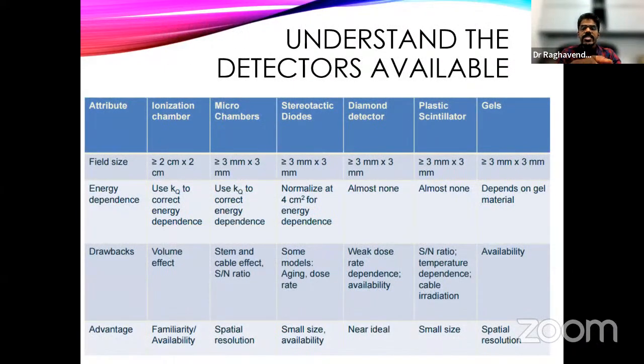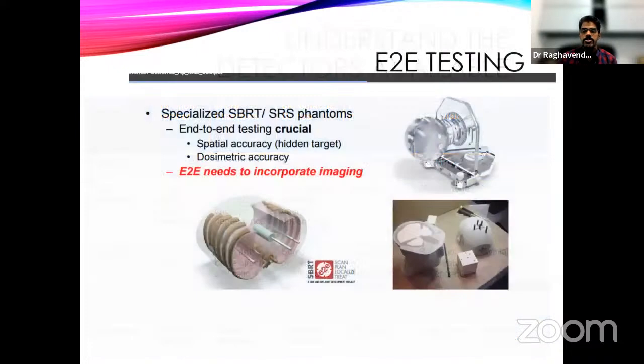So understand the chambers: what chamber you have, how you can use it, and where you have to use it. What are the advantages as well as the disadvantages of each chamber. There are publications available where many of the advantages are discussed in detail. So understand them, and discuss with your seniors if you have questions on that.